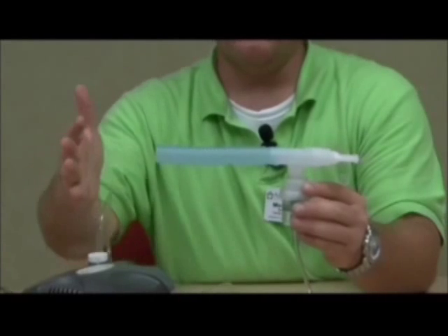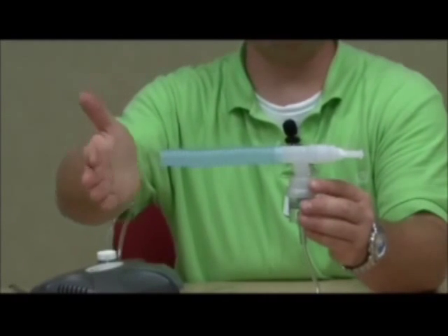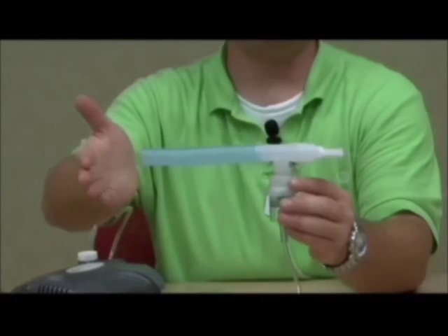Now, as you notice, there is a mist or fog that forms. This is what you should see while doing your treatment.